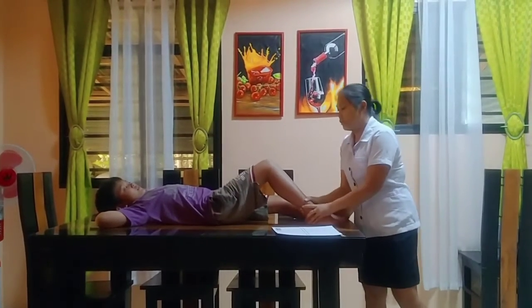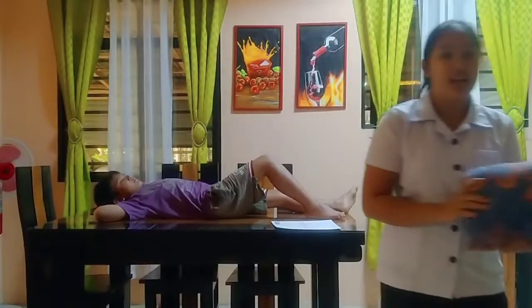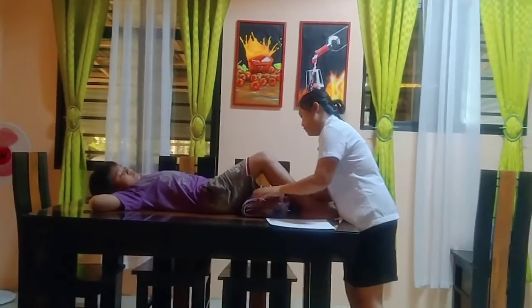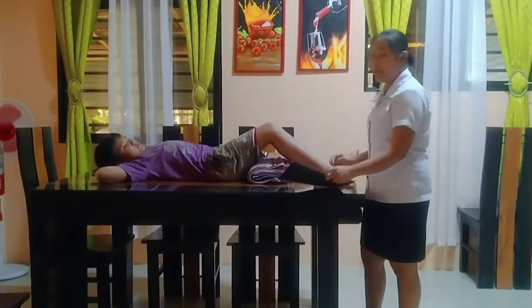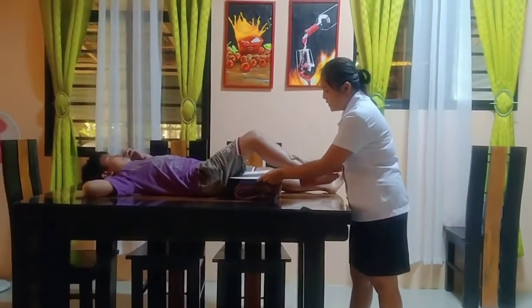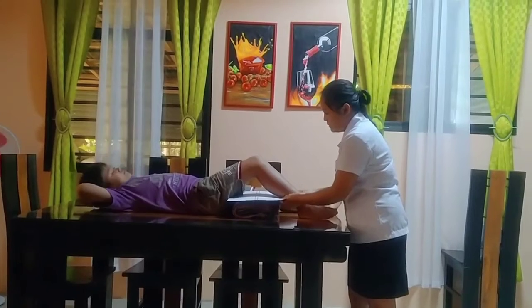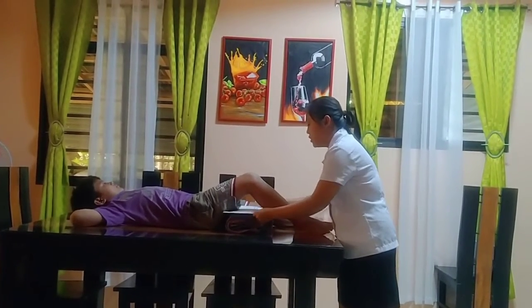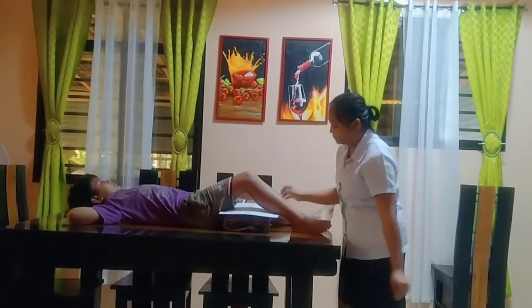For the patient's comfort, kailangan po natin ng sandbag, but gagamitin po natin ang kumot. At ilalagay po natin ang IR dito sa baba ng knee ng pasyente to lessen the OID.